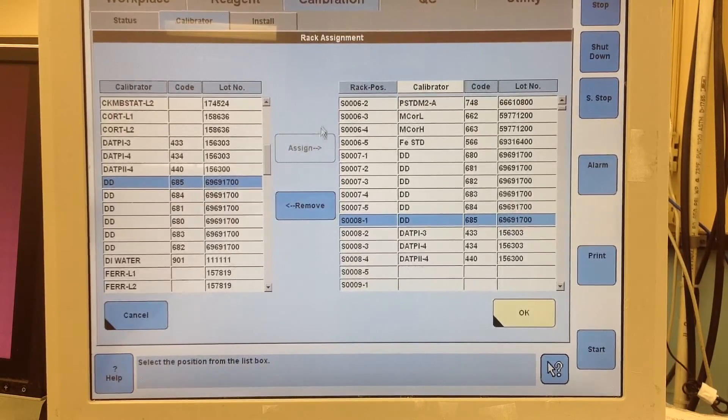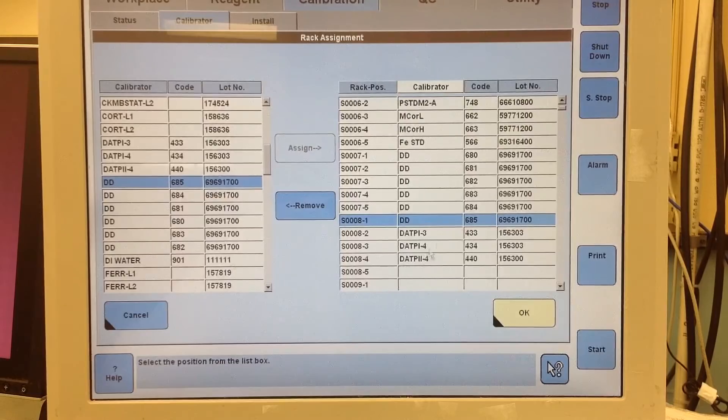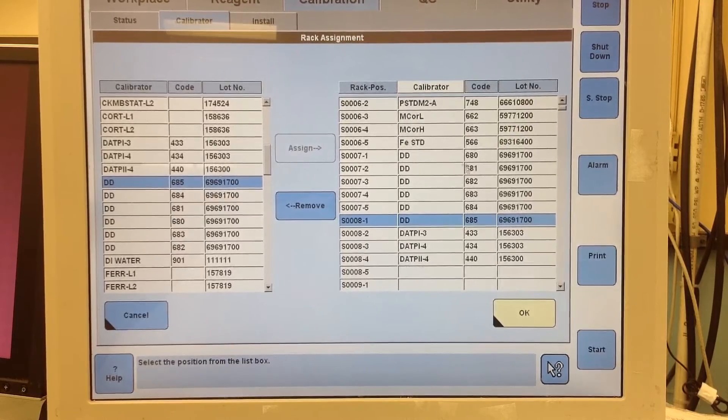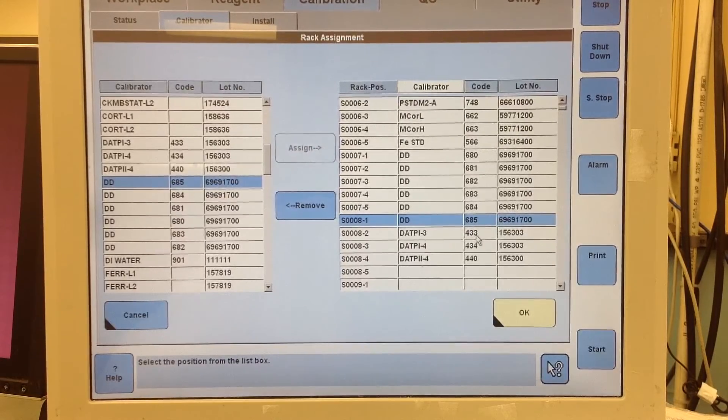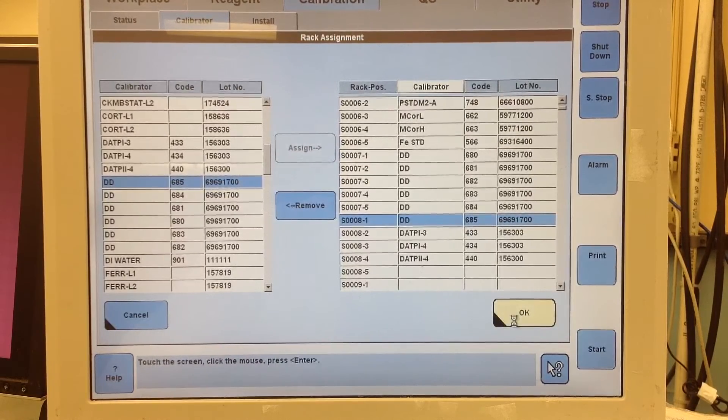So once you get them in there, just make sure it's alright. 680, 685. Then just hit OK.